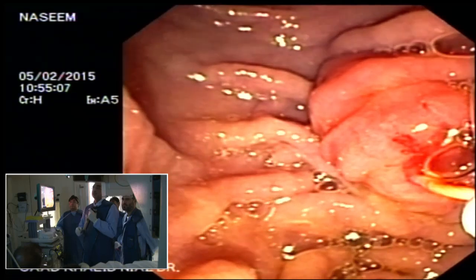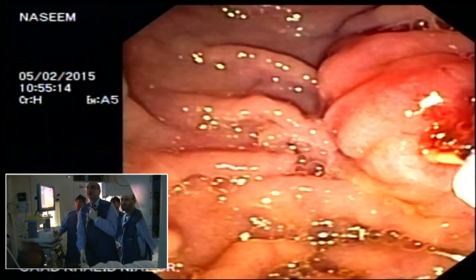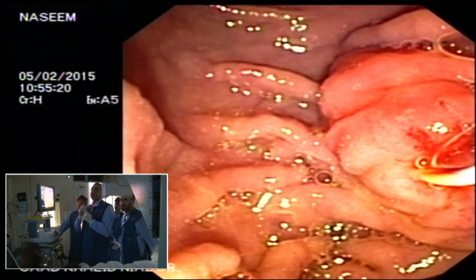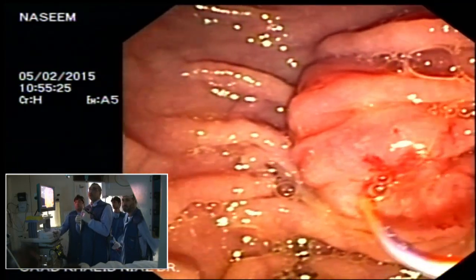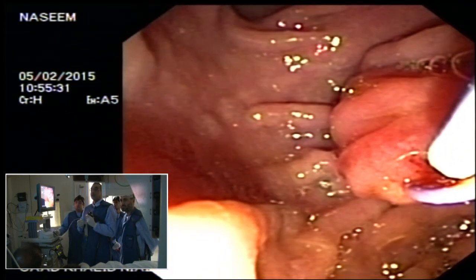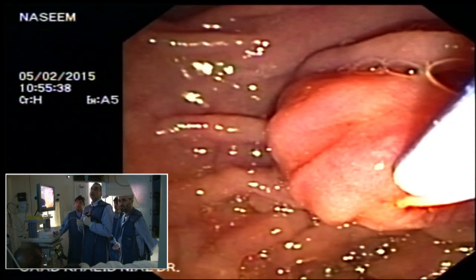Waqar, I know you're... Yeah, I'm just looking at the direction of the cut that we are going to make. Okay, I know you've been very patient, and I appreciate it. I'm just going to have a look at the direction that I should need. While you're at it, you've got good pancreatic access here. Do you ever de-roof the ampulla using that access that you have?